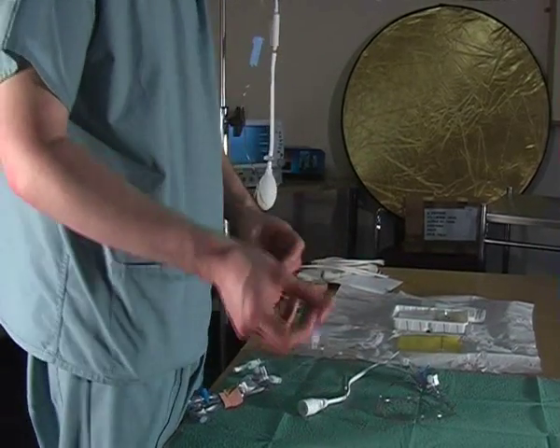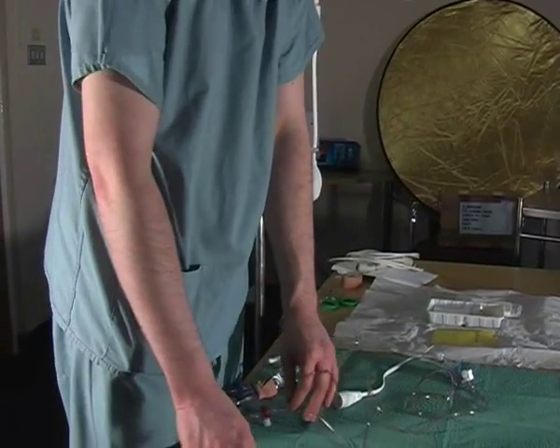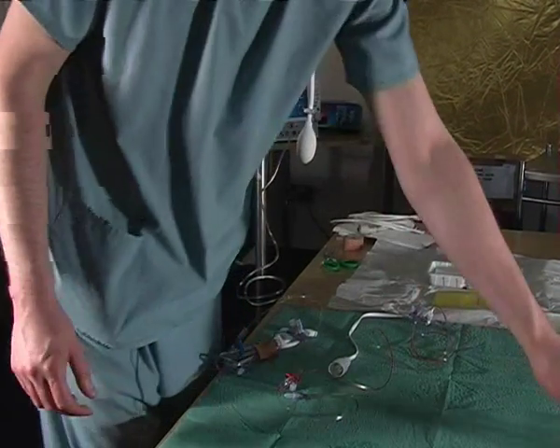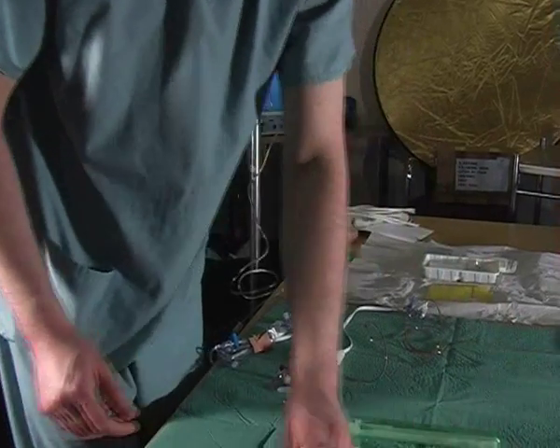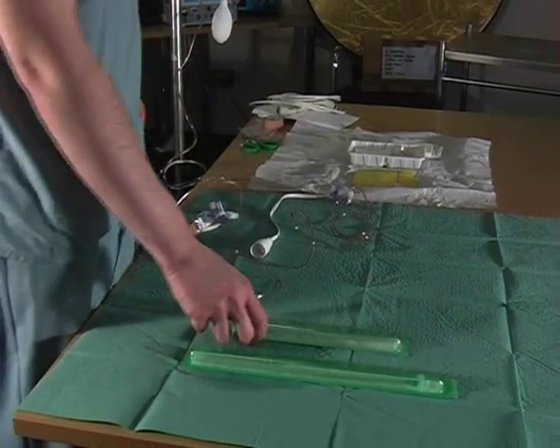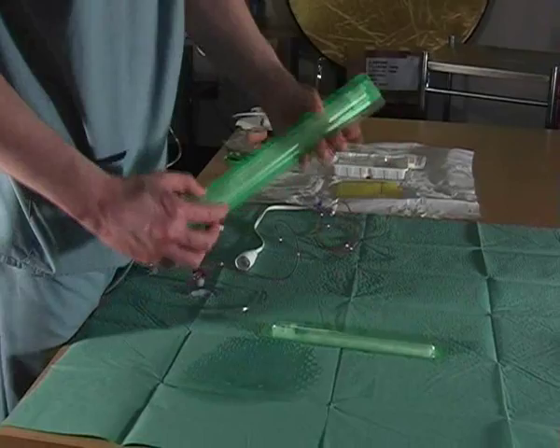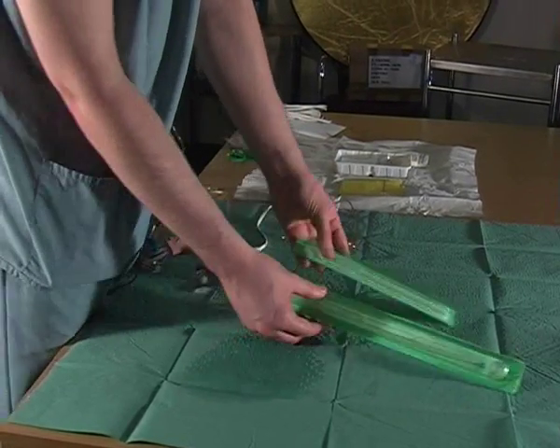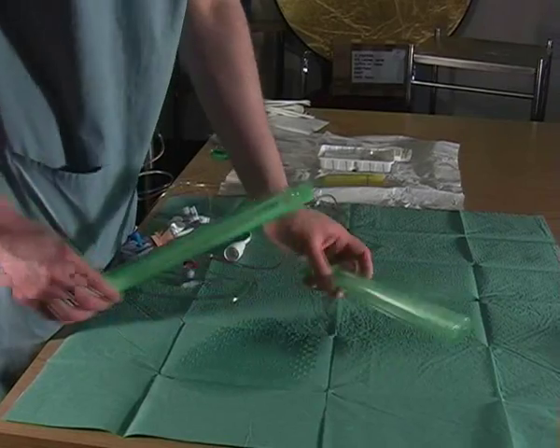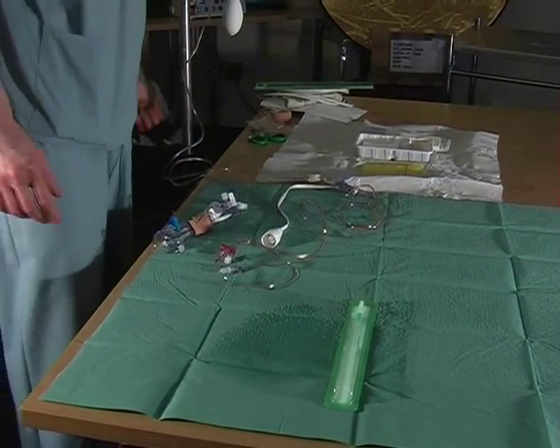The line is now ready to go onto a transducer. The next thing is site selection for where they are going to insert the arterial line. This is a radial and this is a femoral line, and as you can see there is quite a difference in size. For the purpose of this film we are going to use a radial arterial line.